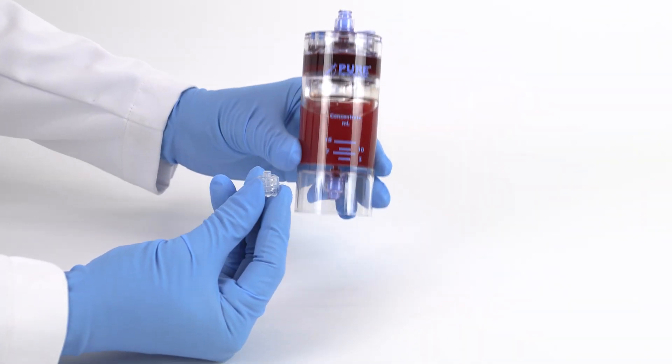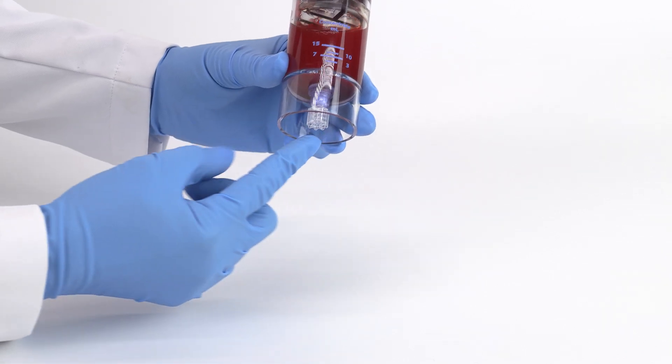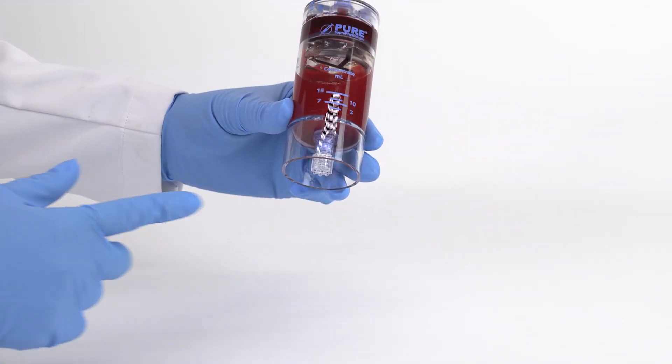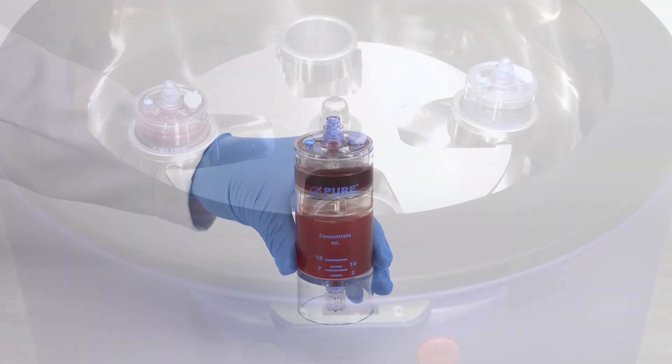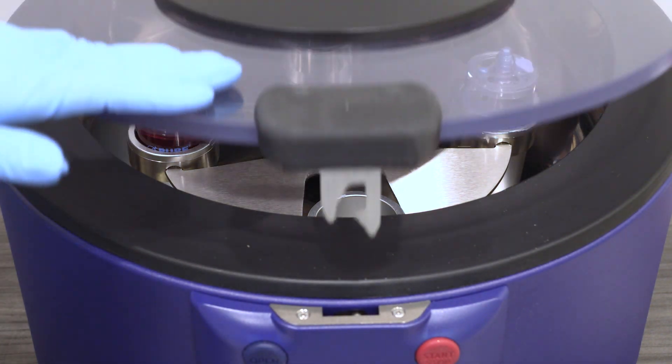As a mandatory step, always attach the clear non-vented cap to the bottom port prior to centrifugation. Place back into the centrifuge rotor at opposite ends. Follow the protocol settings provided in the IFU insert, close the centrifuge lid, and press start.